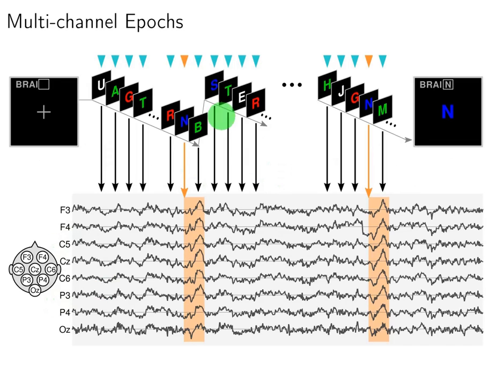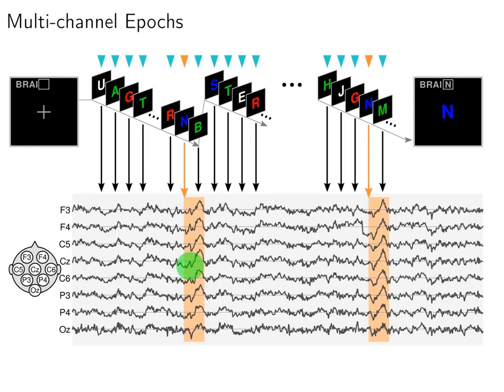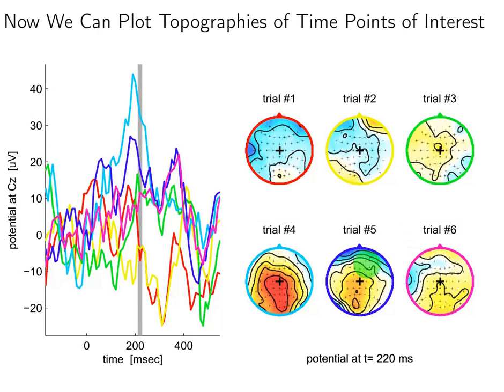For example, in a multi-channel case, we're not only recording a single channel, but multiple channels, and then constructing feature vectors from each individual channel as one tall matrix. That could correspond to a target event, while others are non-target events. Well, if we visualize those multi-channel features, collected at some fixed time point, as a topographic image across different trials, we can see this color-coded distribution of ERPs.